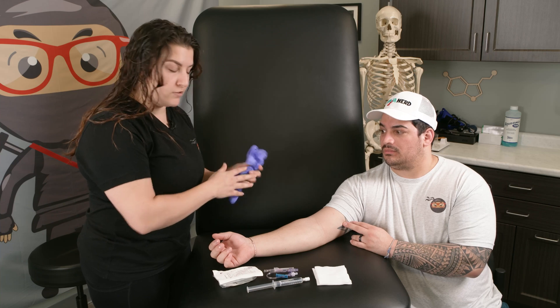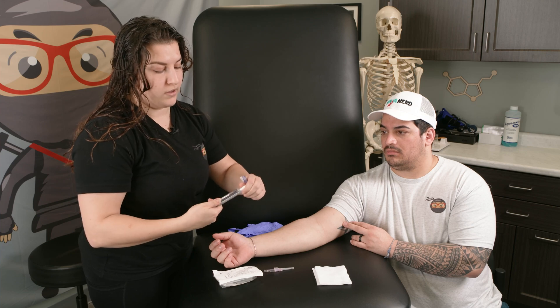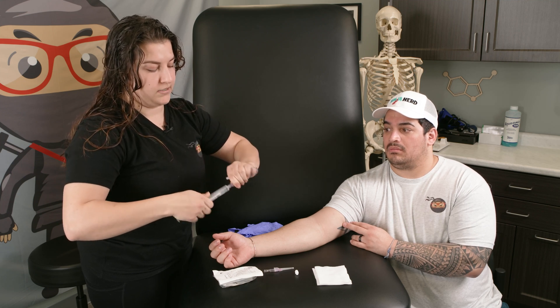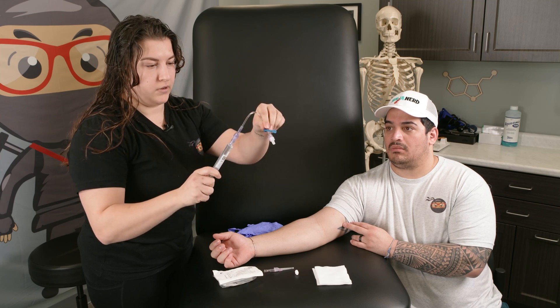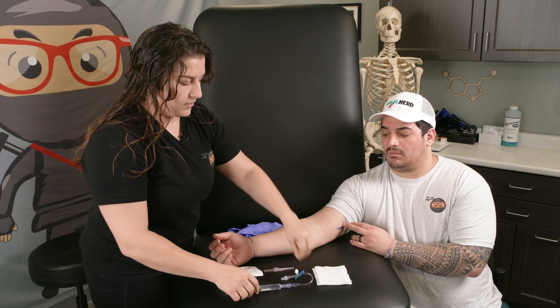Gloves are always important, some gauze. You want to grab your sterile saline and your loop — they vary by facility. What you want to do is open it; it starts with a little bubble at the top. You can push that bubble out, or you can attach the tubing and then push that bubble out. You'll see some fluid come out the top. I like to see it drip all the way so it's nice and filled, ready to go, with no air in the tubing.